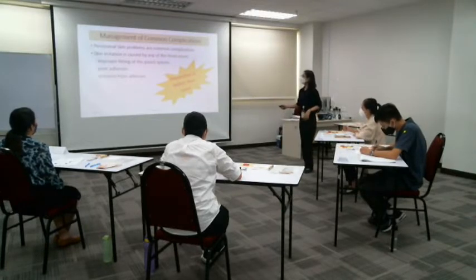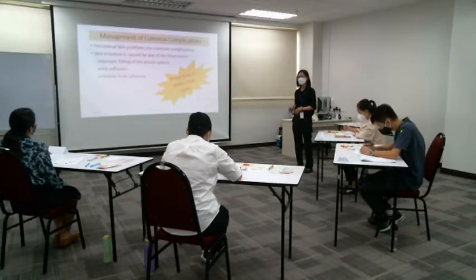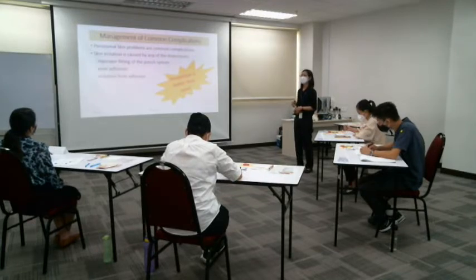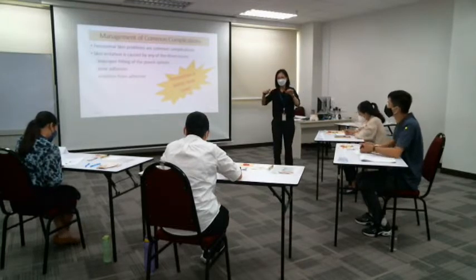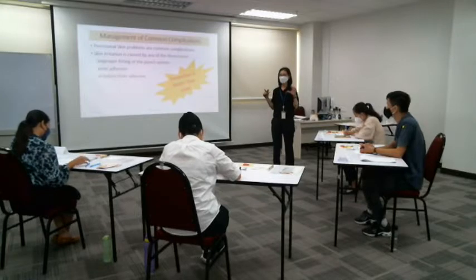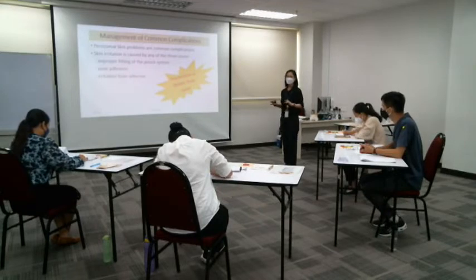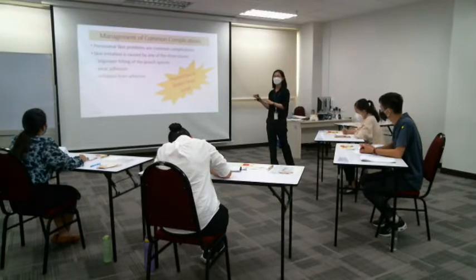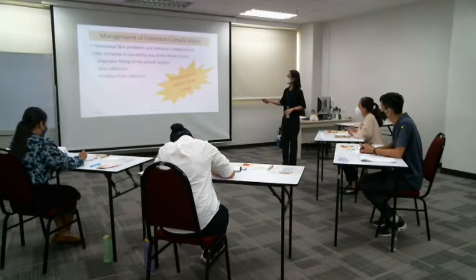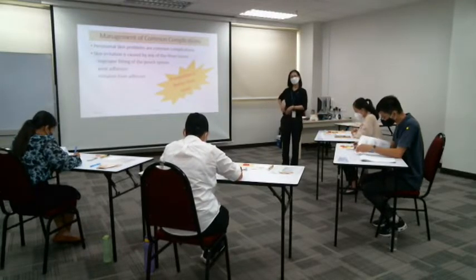All right. So peristoma skin problem is the most common complication. The leakage of the effluent or the outflow can damage the peristoma skin. When we say peristoma skin, that means the skin surrounding the stoma. But anyway, prevention is always better than cure. So you have the knowledge of this, then you must teach the patients to prevent peristoma skin problems. Usually, these irritations to the skin are very much related to improper fitting of the pouching system. They don't fit properly and it leaks.